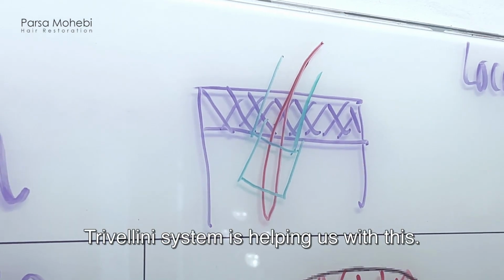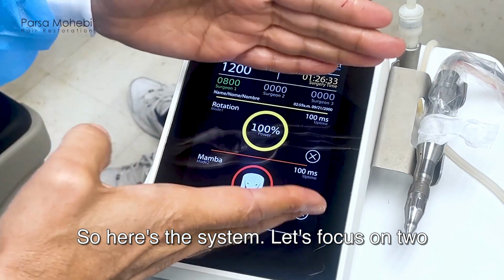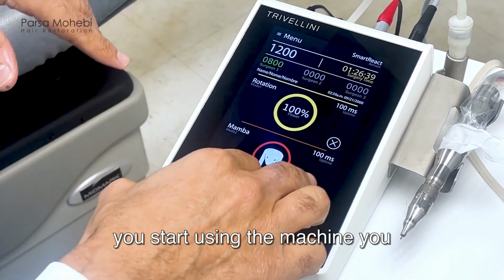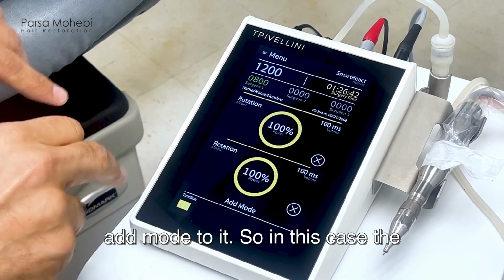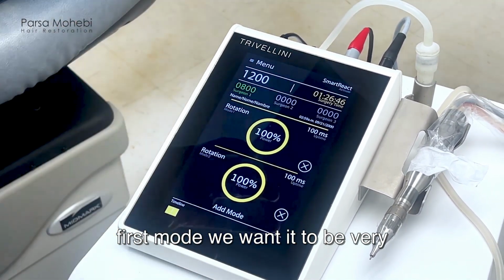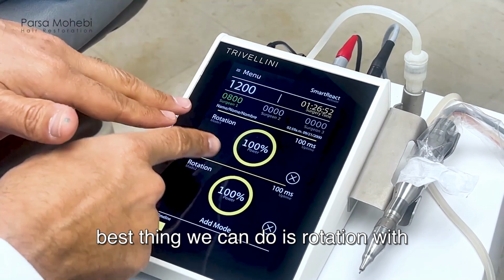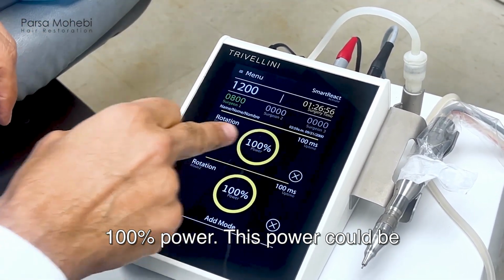So the Trivellini system is helping us with this. Here's the system. Let's focus on two phases, phase 1 and phase 2. Of course, you can add more phases. When you start using the machine, you see that for one phase, you can add a mode to it. In this case, for the first mode, we want it to be very sharp, very powerful to cut through the superficial layers of the skin. The best thing we can do is rotation with 100% power. This power can be adjusted.